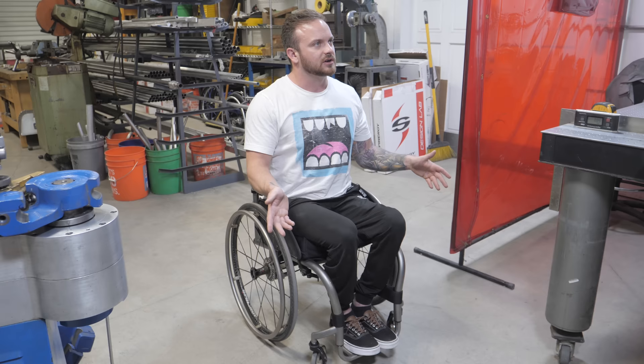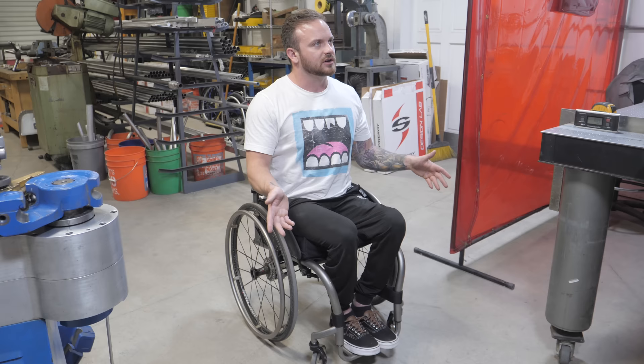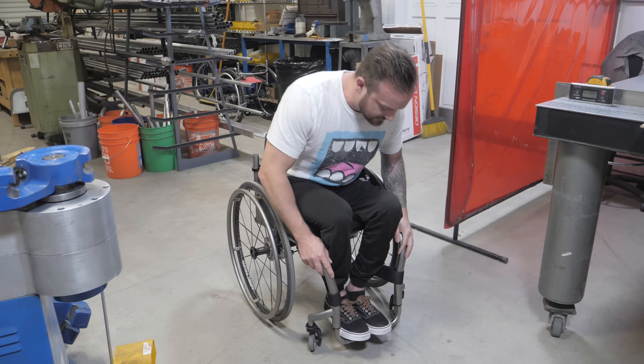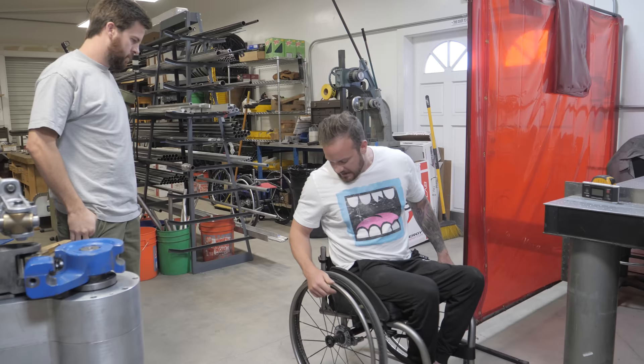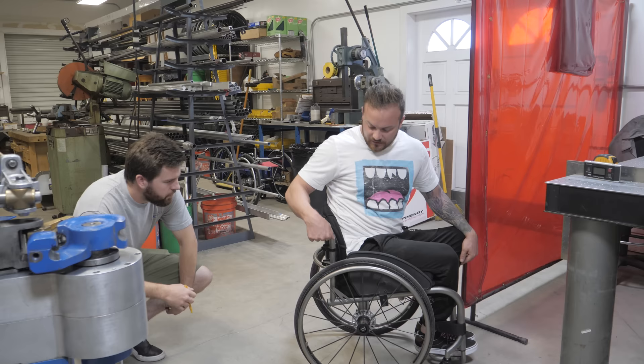That was kind of sold to me originally by the person who fit me — they said, 'Oh, you don't know what kind of shoes you're going to wear. If you wear bigger shoes, you want some more playroom.' But I always find myself wearing the same shoes. I do like the strap, but I'm not sure I like where it's placed. I feel like sometimes it cuts into the back of my ankle, especially if I wear shorts. I would like to be able to push it back further so I can sink further into my chair.